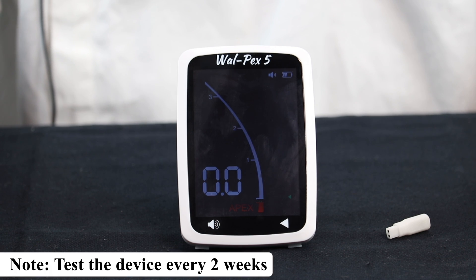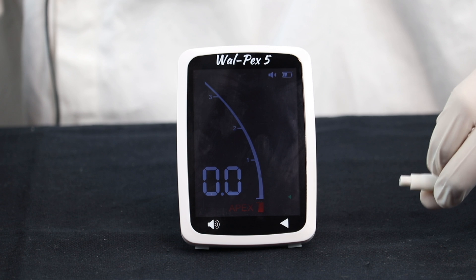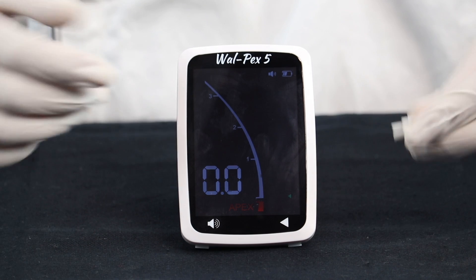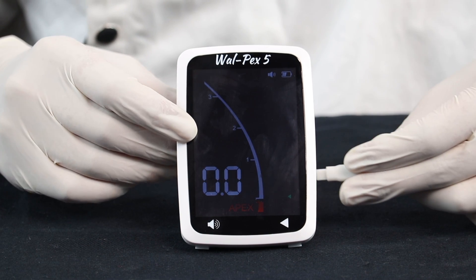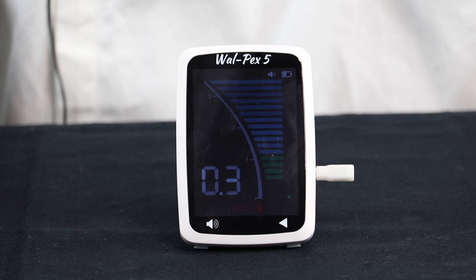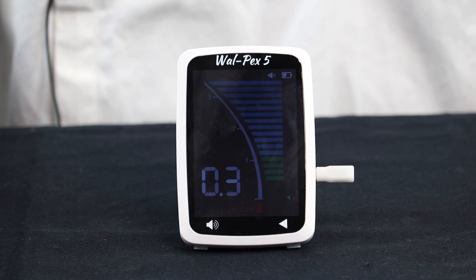Firstly, we will check whether the Apex Locator is working properly or not by connecting this tester. If the numbers displayed on the screen are 0.2, 0.3, and 0.4, it means we are good to go. As you can see, it is showing 0.3 — it means we can go ahead.